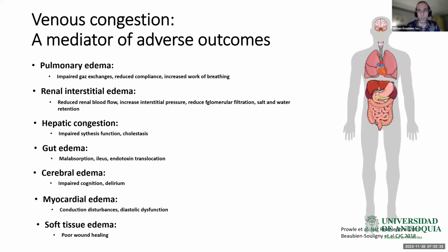The proportion of patients with normal and abnormal portal vein and intrarenal vein is presented here. The second study showed that the risk of AKI was higher when portal pulsatility or abnormal intrarenal Doppler were present on admission to ICU after cardiac surgery. In fact, likely a congestive AKI etiology in that context.